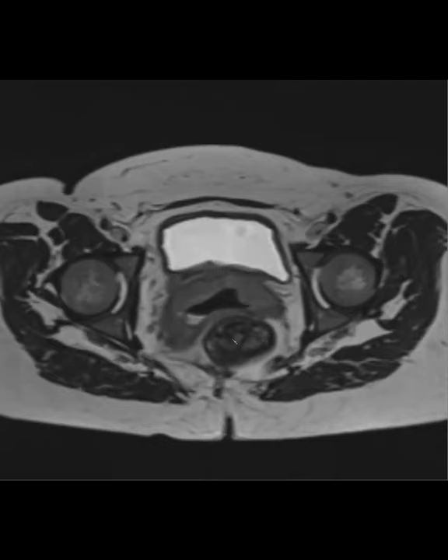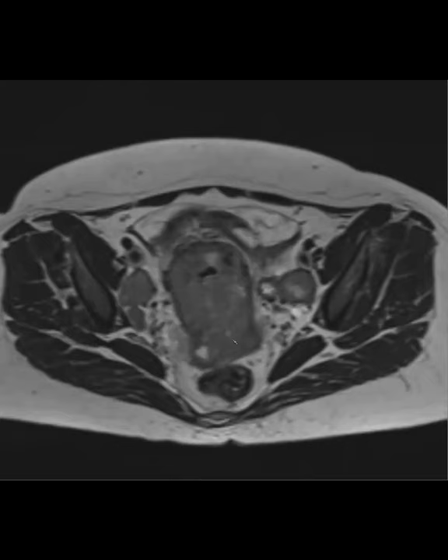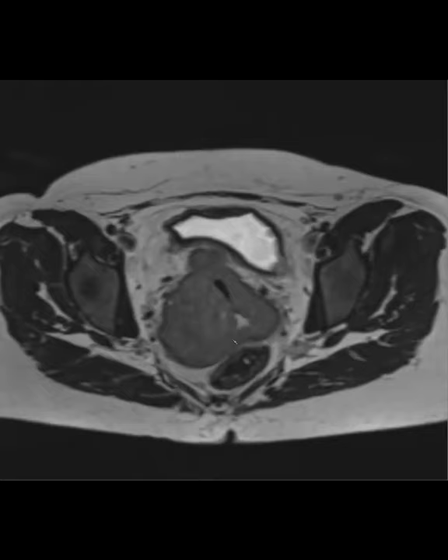So I have three cervical cases. I just wanted to show them kind of back to back. This one is a typical cervical cancer. 90% of them are going to be squamous cell and affiliated with HPV infection. So the incidence is decreasing now that there is an HPV vaccine. But this one is a pretty advanced one.